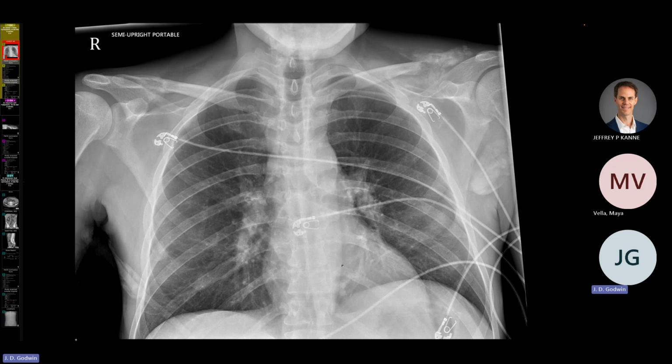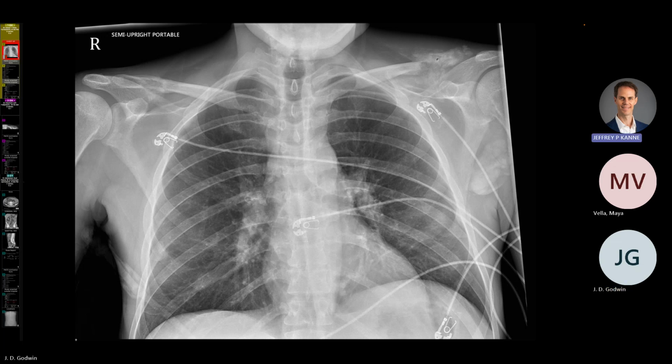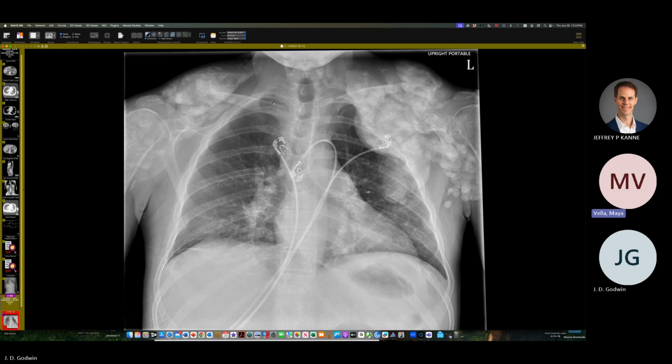So the years were not kind, and I may have to go back to the index here to proceed to the next. Let me see if I can bring up clavicle surgical, or is that, it looks like this is not surgical. So that's an erosion. Yeah, because there's some weird matrix around it. This process has really accelerated. This is only a couple of years after that, and now you can see all of this heterotopic ossification here, or calcinosis here.